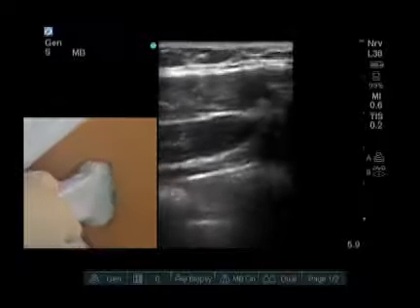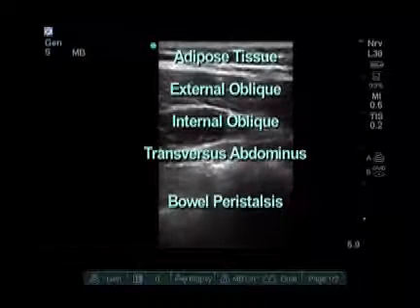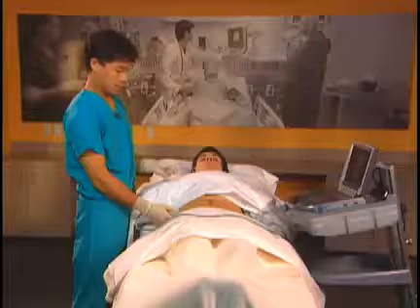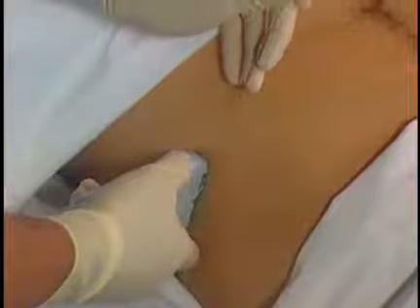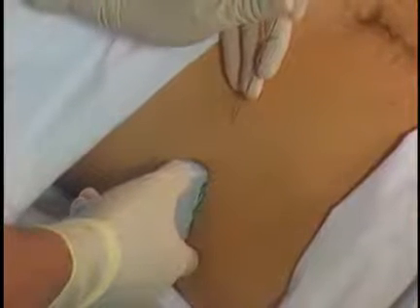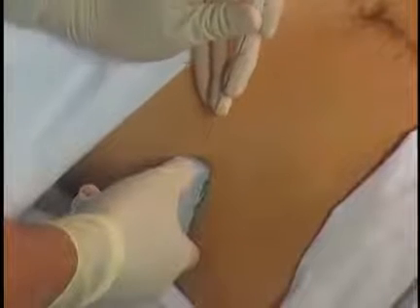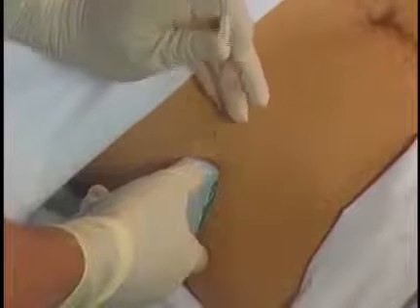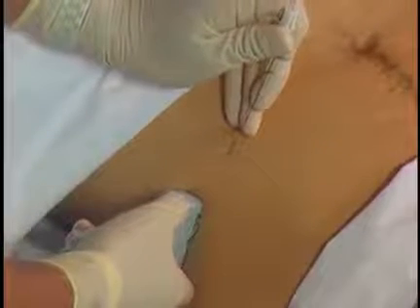To actually do the block, I turn my probe 90 degrees, keeping those planes on the picture. I still see the external oblique, internal oblique, and transversus abdominis deep. My needle approach is going to be from anterior to posterior. It's important to start several centimeters away from the probe in order to see the needle well. If you start too close to the probe, you'll have a sharper needle angle and will not visualize your needle as well. Flat needle angles far away from the probe will allow you to visualize your needle.